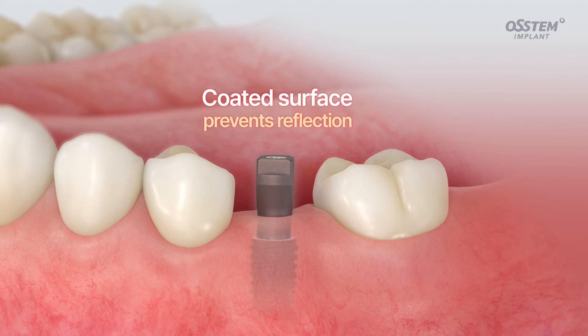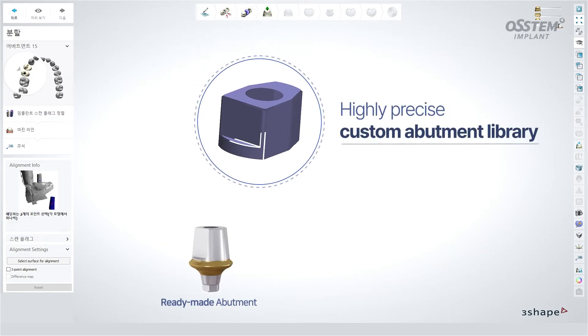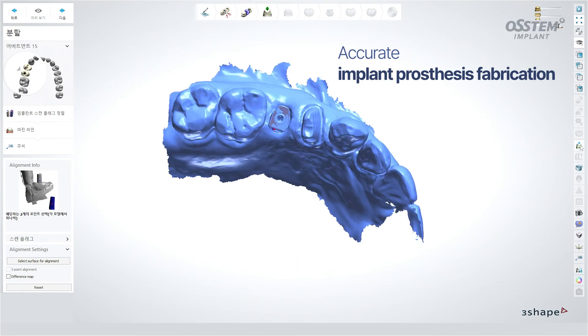The coated surface reduces reflections so clinicians can scan quickly without spraying any additional substances. You can fabricate implant prostheses with great accuracy using the high-precision ready-made abutments and a custom abutment library.